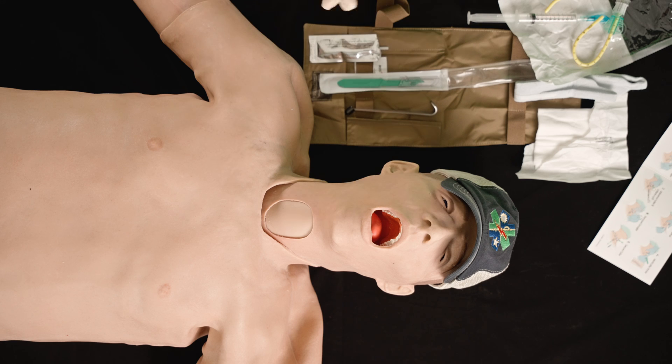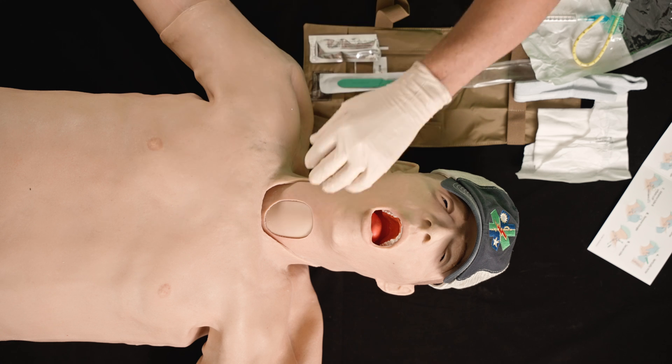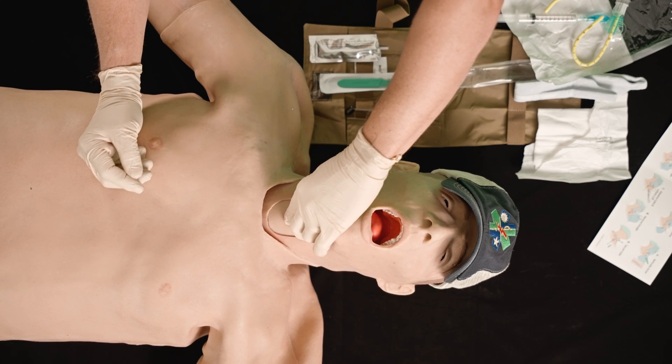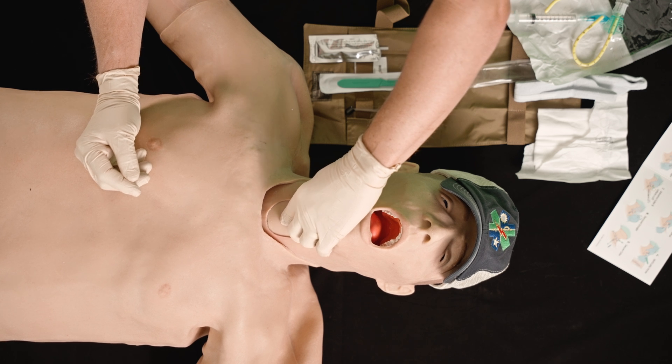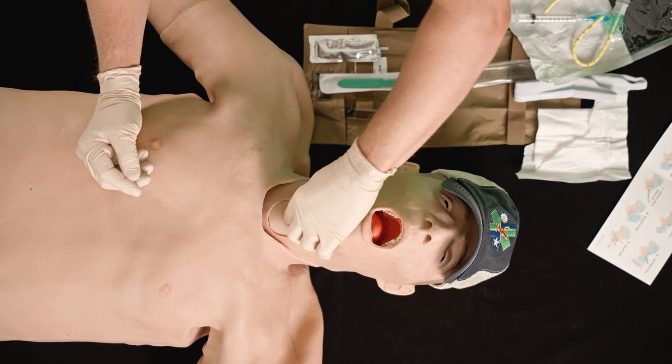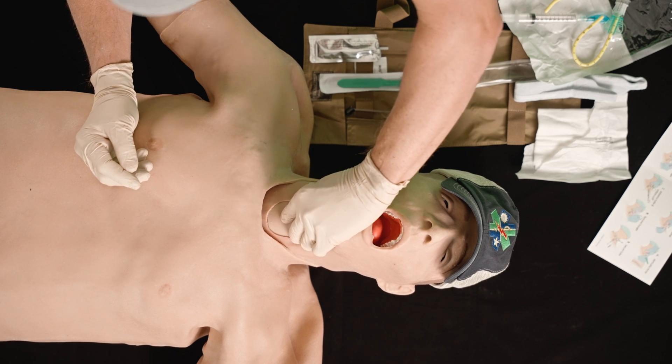The next thing I'm going to do is find my key landmarks — specifically the cricothyroid membrane, which you can see in this illustration. The cricothyroid membrane is a small, thin membrane that feels like a little soft spot right between your cricoid cartilage and your thyroid cartilage. I've found that.